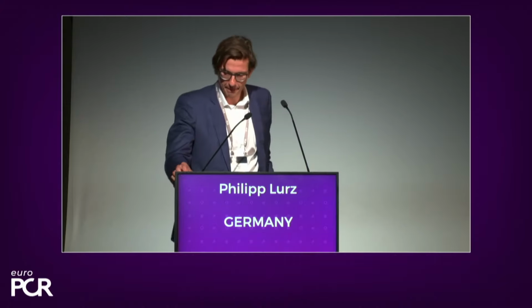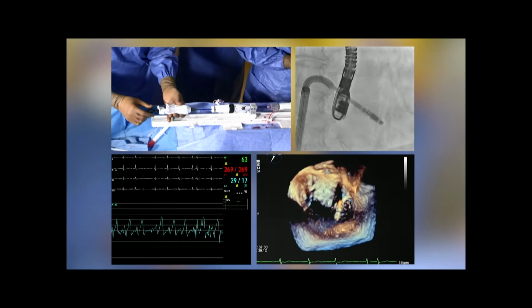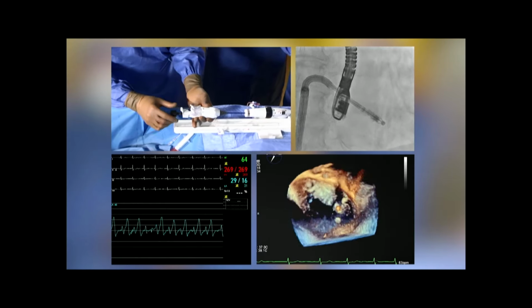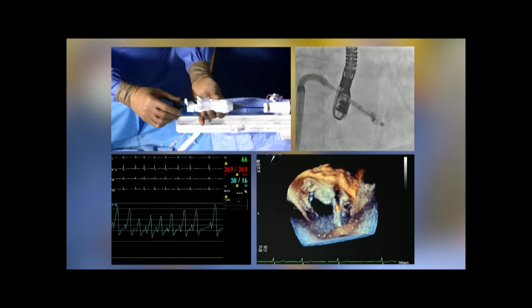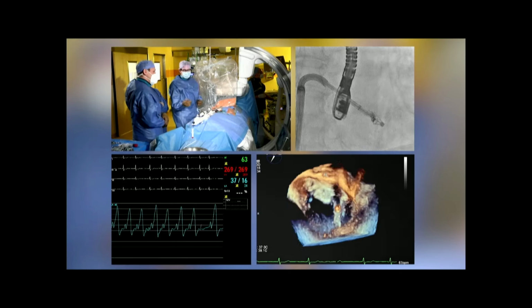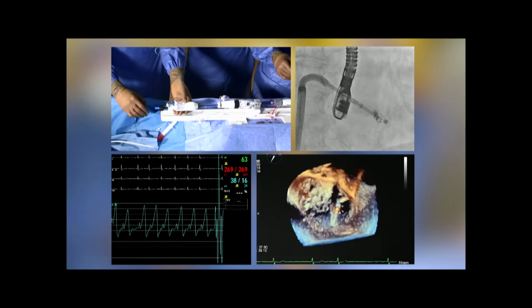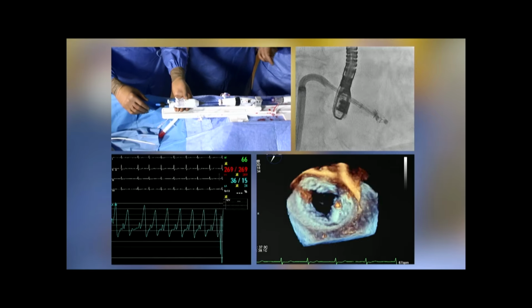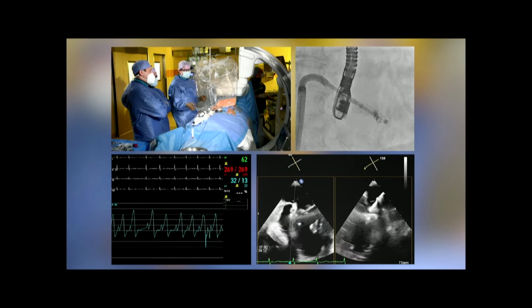So if we turn a little bit more counterclockwise, we are respecting more the line of coaptation, and we're more perpendicular to the line of coaptation in this very medial commissural part of the mitral valve. Okay. Now we can appreciate that the clocking is much more 6 o'clock than we wanted it to be. So yes. And again, it makes the point, some things you can appreciate better once you open the device. Pressures go up now again. That's to be expected, yeah. We will do the clocking in a second, but I'd also like to come more medial. Okay, let's bring up the clasps.